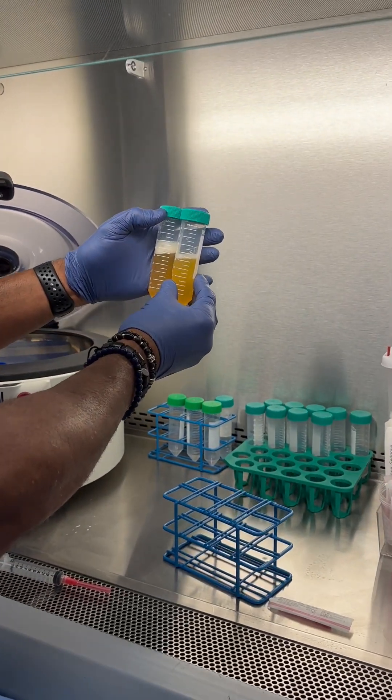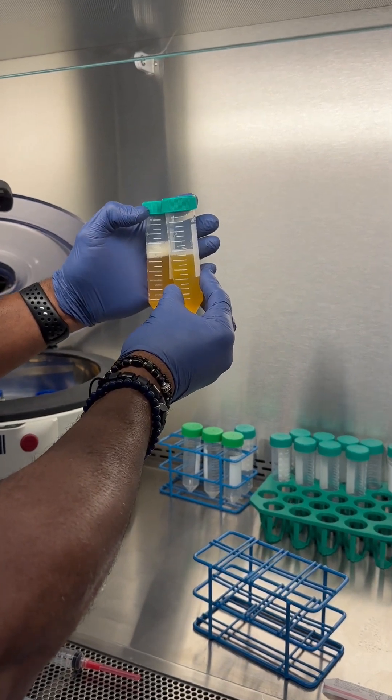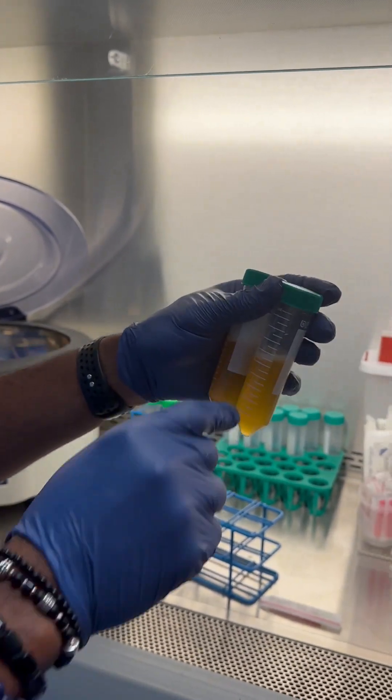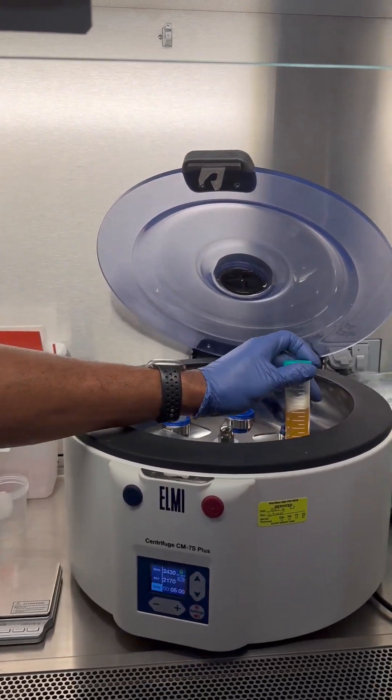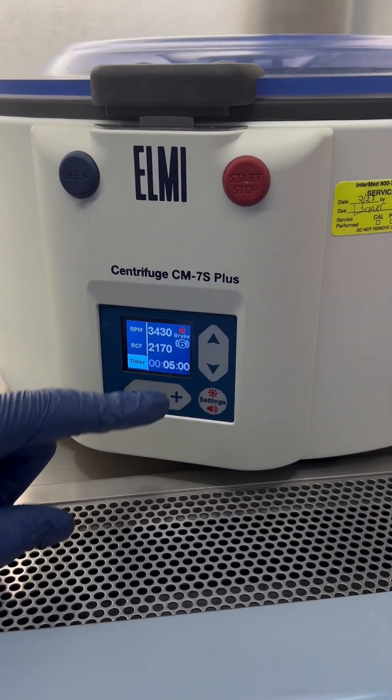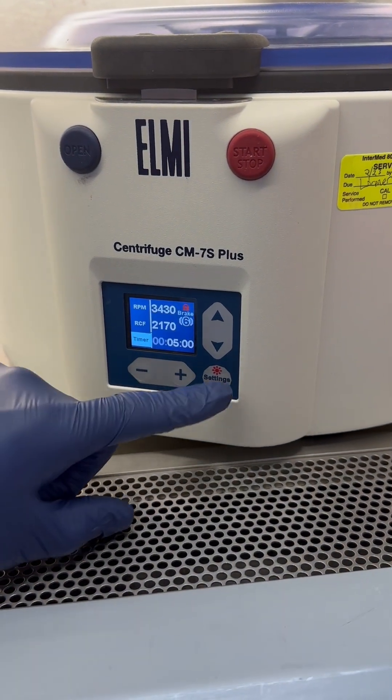These are our two plasmas — they're pretty well matched, just under 30cc. We've balanced them out and we're going to place them on opposite sides. Five-minute spin, same RCF at 2170, brake has been increased to six. We're going to hit start.